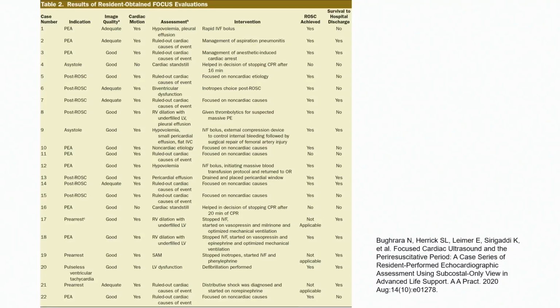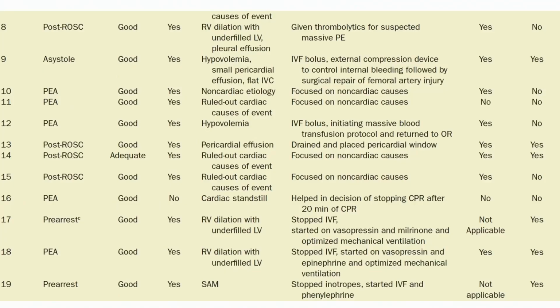Moving on, this is a case series of anesthesiology resident performed ultrasounds. After limited training, they only had 4 days of training. They completed this ultrasound pre, post, and during cardiac arrest, depending on the clinical scenario. And this was completed by our own Dr. Bugrara, who is the creator of the Easy ALS protocol. And I'd like to draw your attention to some of the findings and changes in management that occurred.